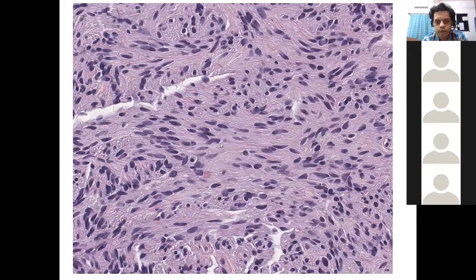Okay, so here you have those bland, slightly Schwannian cells, a bit of zigzag wavy contour over here. So at a higher power, that is how the cells will look. They look fusiform to spindle, elongated. Can you appreciate the fibrillariness of this cytoplasm? When you have a not uniform appearance, as if there are small fibrils within the cytoplasm, that is what we call a fibrillary cytoplasm. It applies in the case of glial tumors as well as in the case of peripheral nerve sheath tumors.